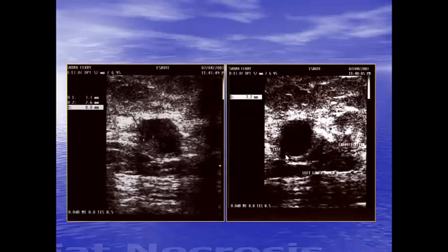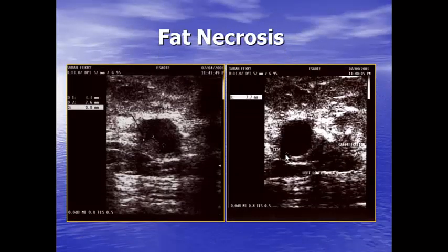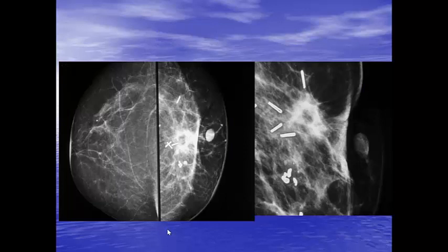So take care. And this was her ultrasound appearance, and this is the appearance of the oil cyst with associated calcification surrounding and in the wall of the oil cyst. And here there is enough of echogenic, which is another spectrum of the appearance of the oil cyst in the ultrasound. So this is a case of fat necrosis. This is another case. It's markedly distorted contour of the breast. It's post-operative. There is a skin dimpling, and this is the scar showing fat, entrapped fat inside, or fat necrosis with dystrophic calcification and sutures. So this is another case of fat necrosis.